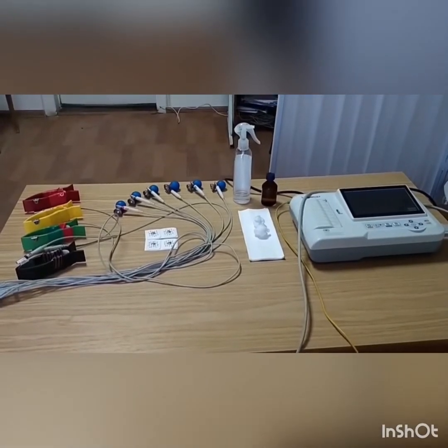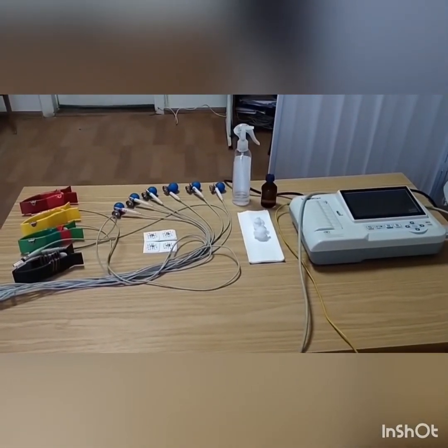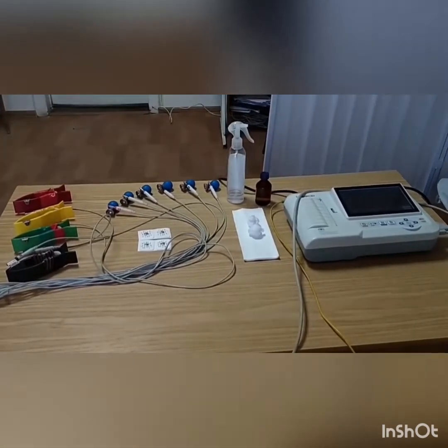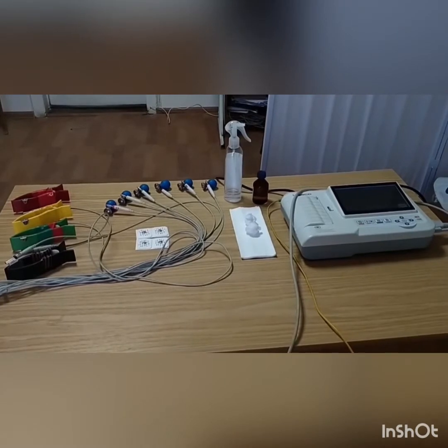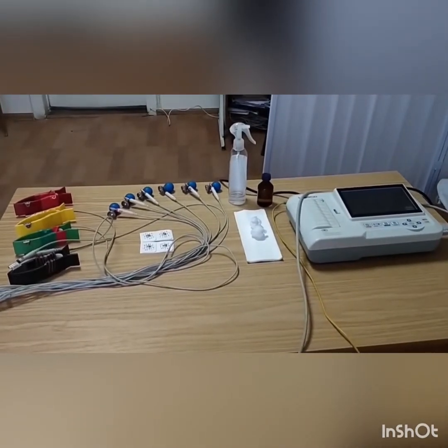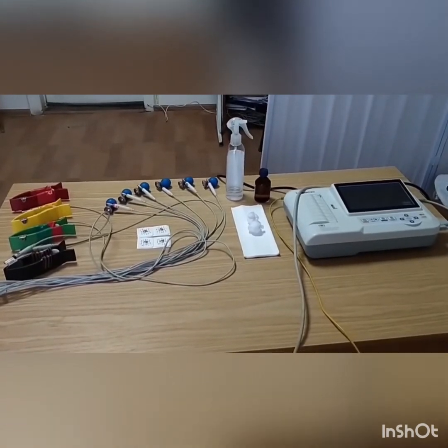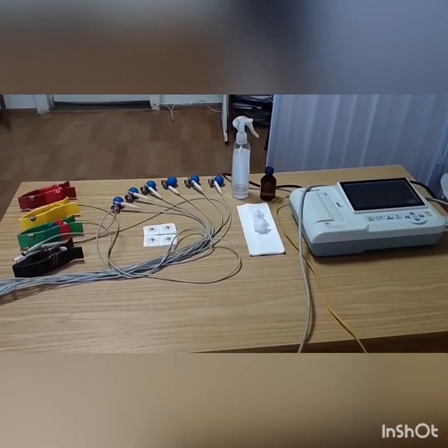Before performing an EKG, we suggest that the patient relax in a horizontal position, lying on his back with calm breathing. We also ask a patient not to talk or make any movements during the electrocardiography. We present the equipment that is used to perform electrocardiography. Electrocardiographs are single-channel and multi-channel. With the help of modern electrocardiographs, we can record an electrocardiogram in 12 leads: 3 standard, 3 reinforced, and 6 chest. Electrocardiographs are stationary and portable.